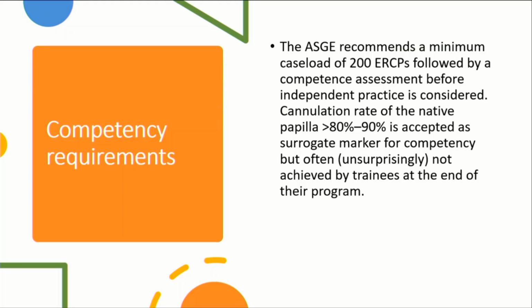I believe that this may be good enough for the basic learning curve, but in my opinion, maybe more than 600 ERCPs would be a reasonable number to start feeling a little bit confident about yourself. Of course, it depends on how many you do. In Europe, where I was trained to learn ERCPs, we do not have the work volume that my Indian colleagues have. So it takes longer in Europe to be trained in comparison to other areas where there are many more ERCPs.